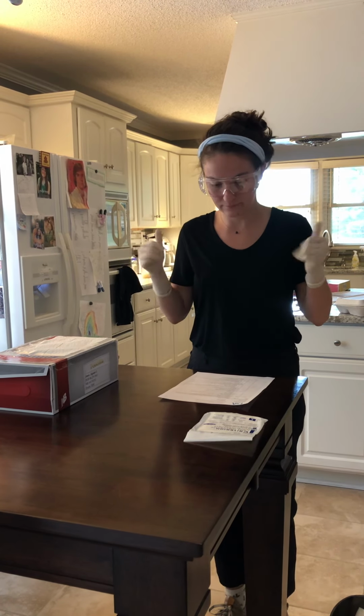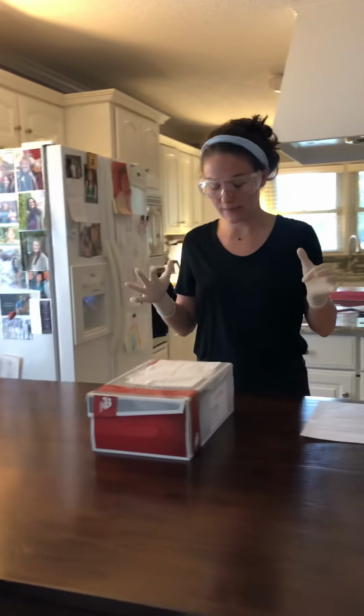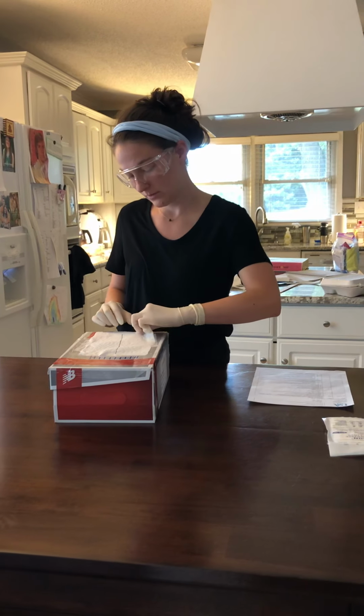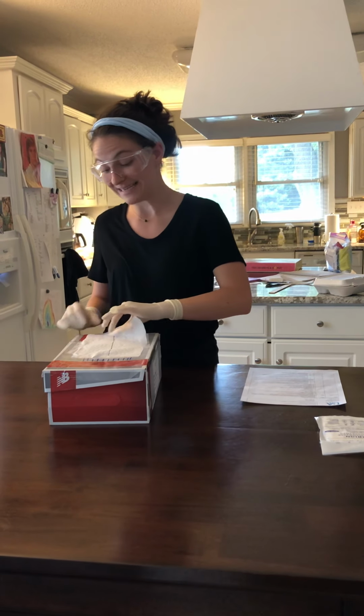Okay, now, Mr. Jones, I'm going to take off your first wound outer ABD pad.